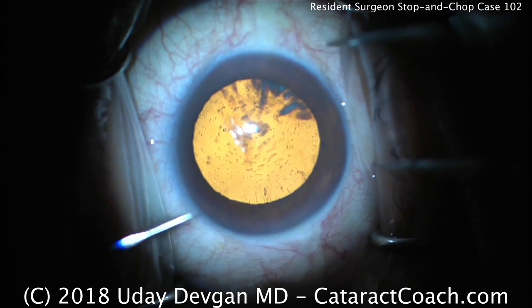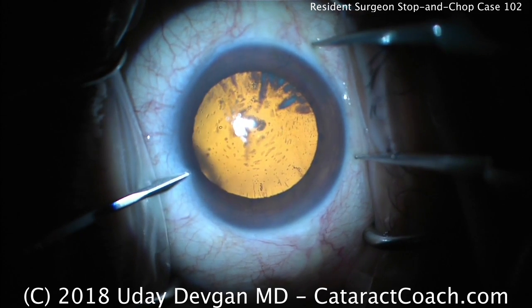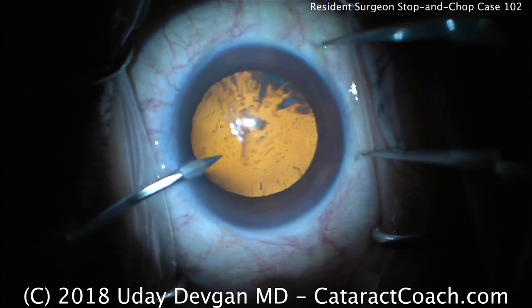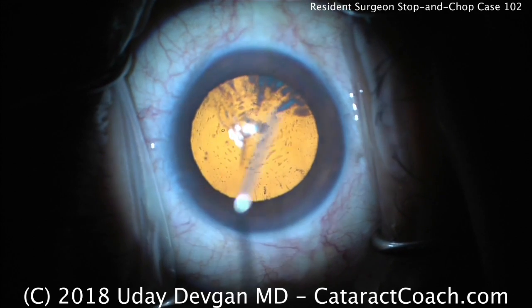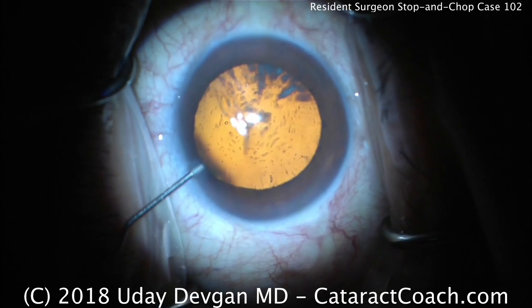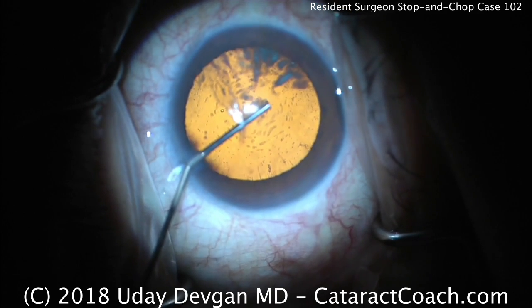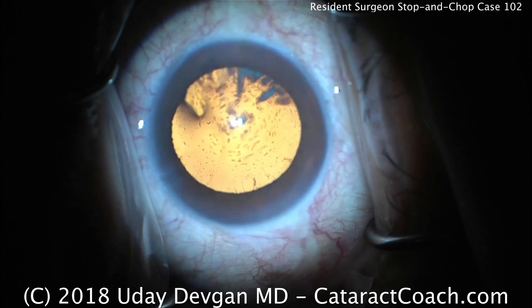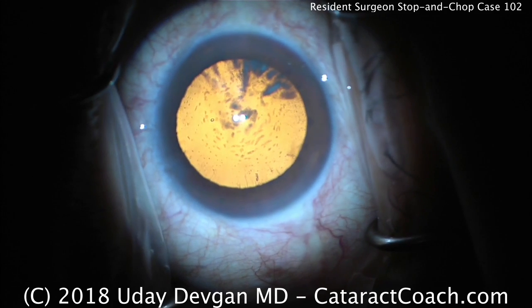This is cataractcoach.com and we're watching a resident surgery. This is August of the senior year for residency here in the U.S. This surgeon has done about 30 cases so far as a primary surgeon. During training here in the U.S., our residents do about 300 cataracts as primary surgeon at our UCLA facility in our training program. That's on the high end of the spectrum for U.S. programs.